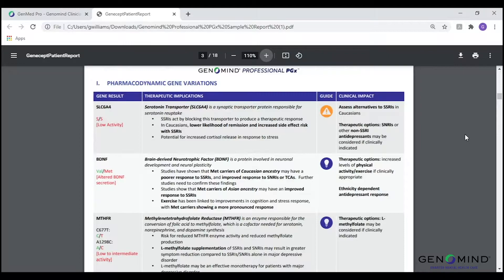Anything highlighted in red on the report will indicate a risk, caution, or change in activity or sensitivity, whereas information highlighted in blue confers an improved odds of response or a protective factor against tolerability concerns. Finally, anything denoted in green on the report is indicative of normal activity or normal response related to that specific gene.